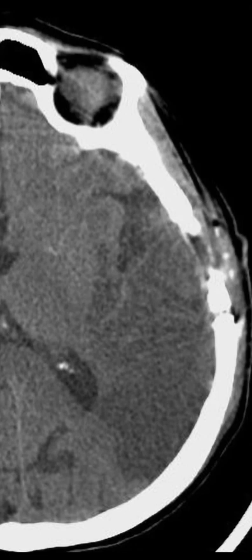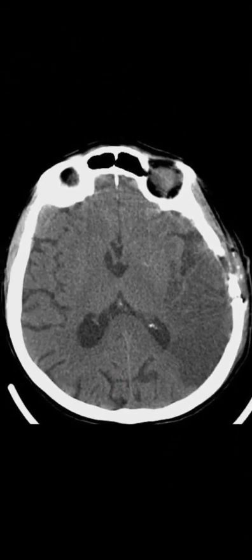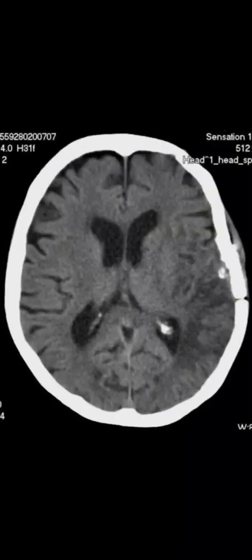At this point, meticulous hemostasis was achieved. The dura was reapproximated. The bone flap was replaced with titanium plates and screws. The scalp was closed in layers. A sterile dressing was applied. The patient was returned to the recovery room, where she awoke in satisfactory condition. The postoperative CT scan looked stable. The CT scan 2 weeks after the bypass continued to show stability, and the patient was able to leave for acute neurorehabilitation.